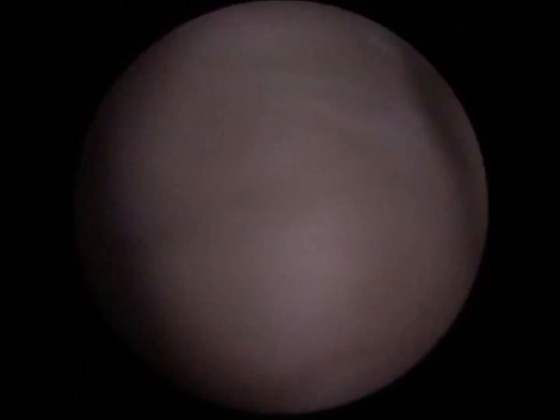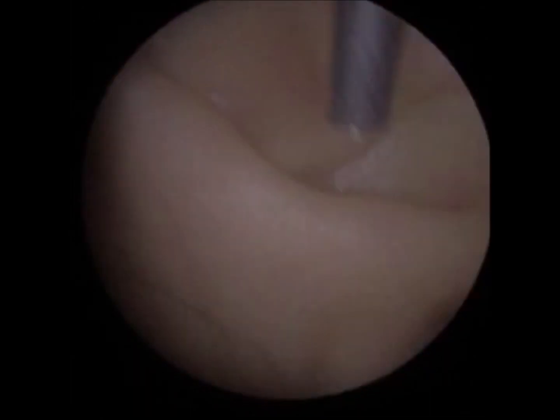Sensitive, unfortunately, because deep in the ear the bone near the eardrum — it's just skin on bone, there's no fatty tissue in between. No, I see. You'd be fine, honestly. You're very safe, thanks.